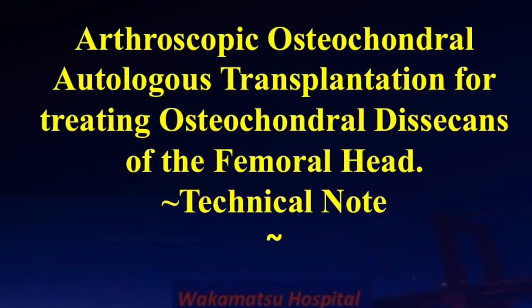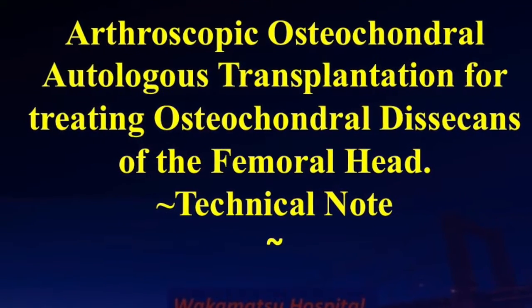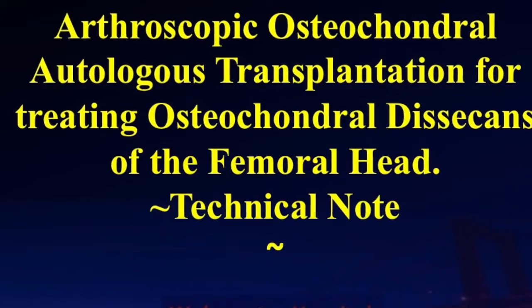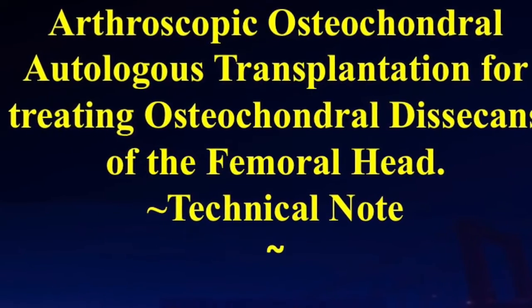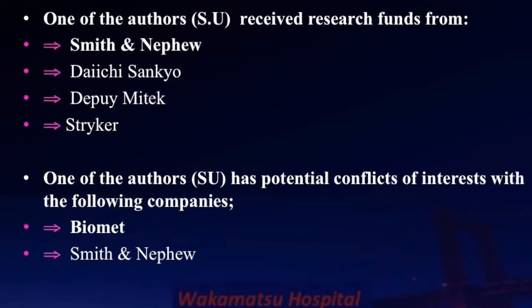This video shows the arthroscopic technique of osteochondral autograft transplantation for treating an OCD region of the femoral head.